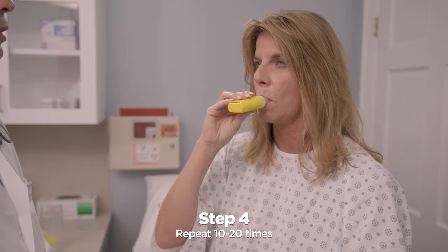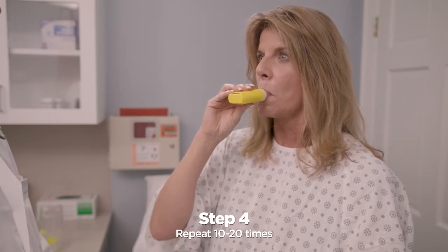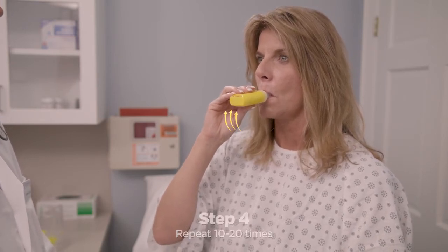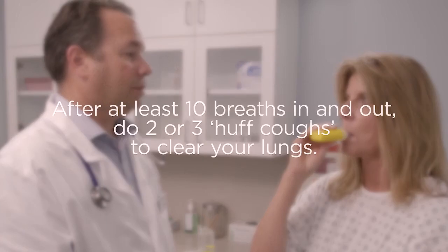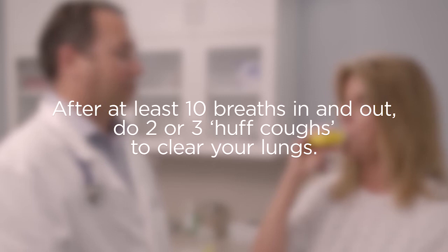Keep taking very slow, deep breaths in and forceful breaths out through the Pocket PEP for 10 to 20 times. Your healthcare practitioner may tell you the number of breaths they want you to take. After at least 10 breaths in and out, do two or three huff coughs to clear your lungs.